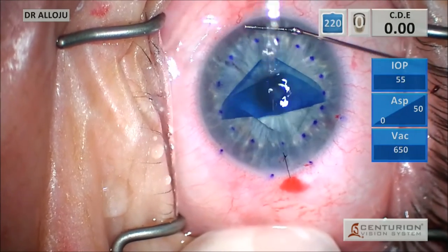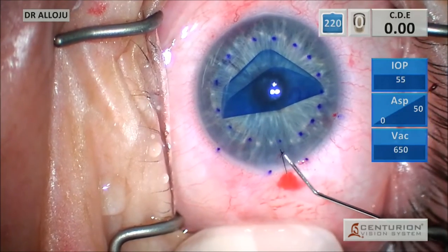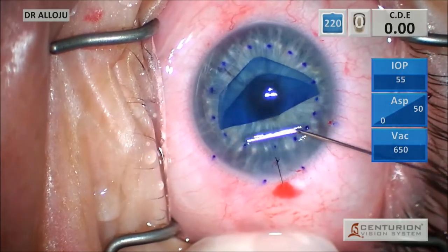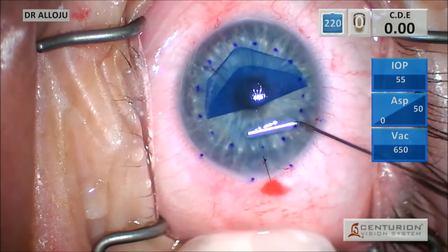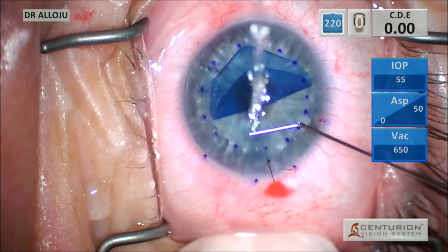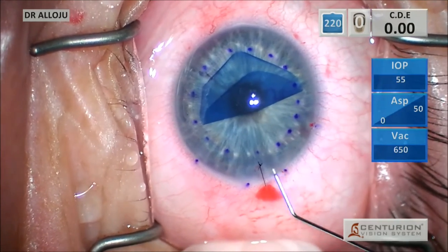So I'm using my left index finger to help form the chamber, and I'm continuously trying to shallow the chamber. Now this is one of my favorite maneuvers, which is kind of like a negative pressure technique. You push down away from the graft and then you release pressure quickly, and that opening up of the fluid current kind of pulls the graft in the direction that you want to go. And then this other one is you can actually just push the graft as well.